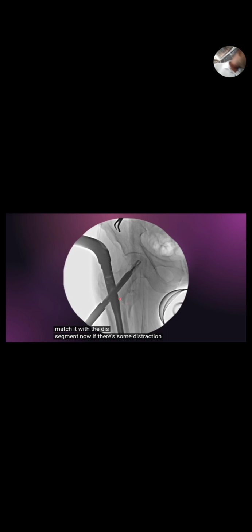Now if there is some distraction, you can gain compression after putting the screw, and once satisfactory reduction has been achieved, you can lock the screw. So we see this is the entry point which should not be made in the fractures in which the fracture line is exiting just lateral to the trochanteric area, and this should be the entry point which we should make in these fractures. So this should not be done, and this should be done.